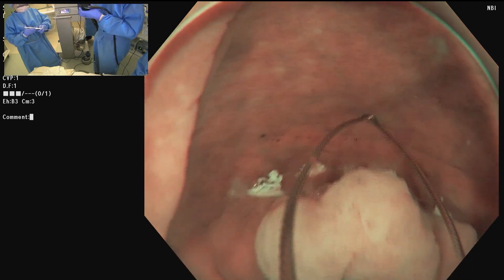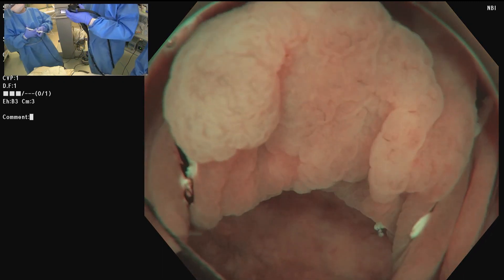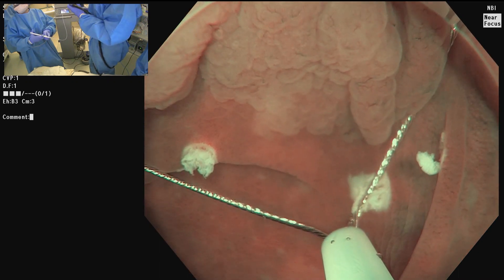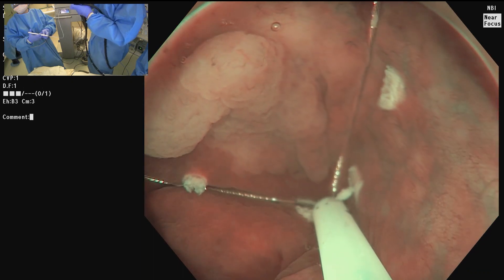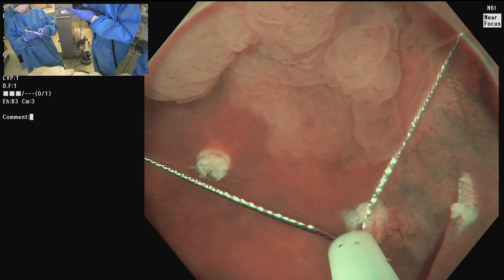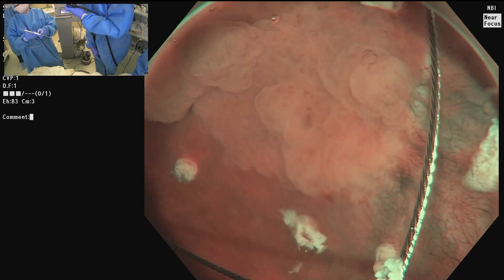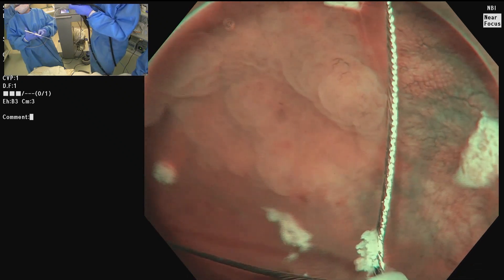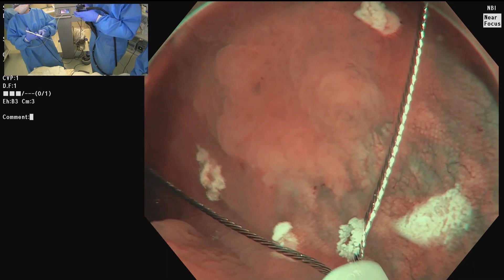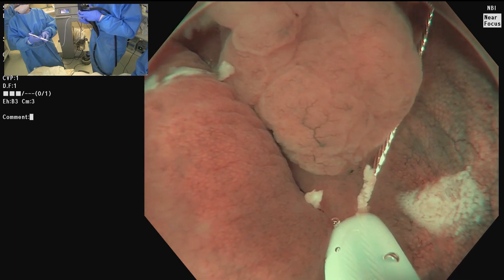When do you consider injecting under the lesion, and what settings were you using to do your marking? Let me show you the technique. We're trying to make sure that the perimeter of the snare is around these dots. There are two ways to displace the lesion up into the snare: first, to-and-fro — push backwards and forwards — looking at how the tissue changes position; second, torque and crimp; and third, a gentle suction — the water pull. I just pull it in a little bit. If this were gas it would immediately red out. See how it just kind of pulls in? Then you can start to close.